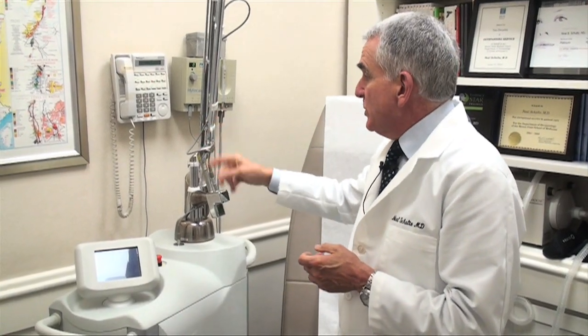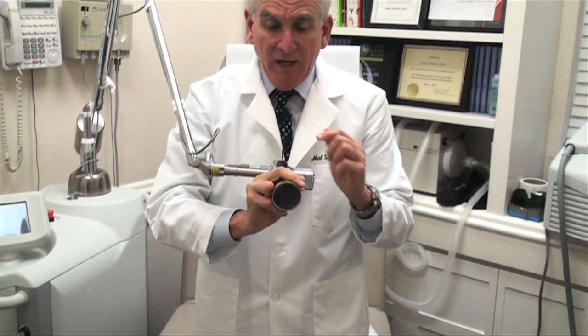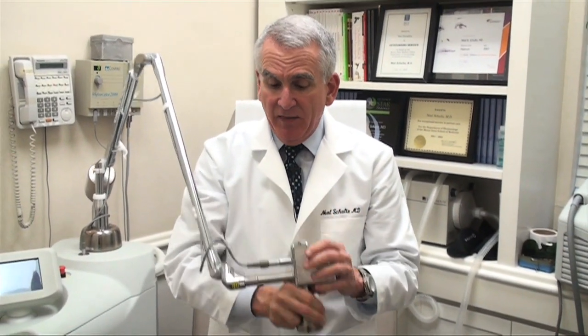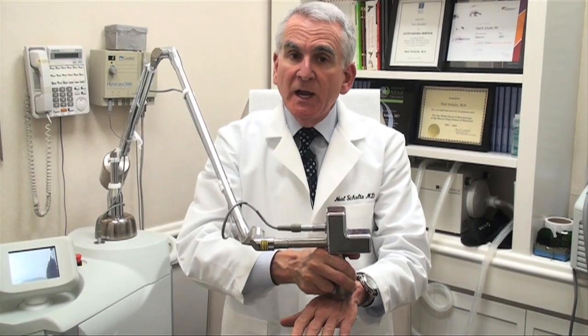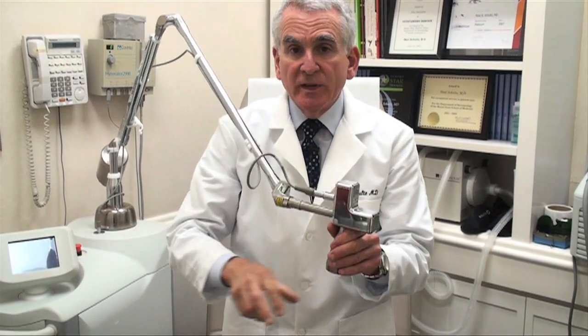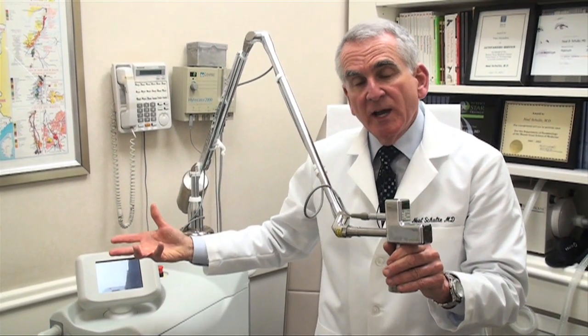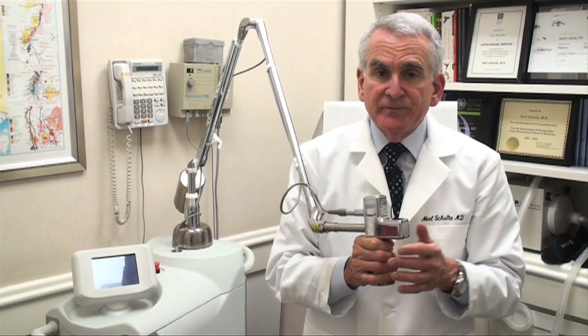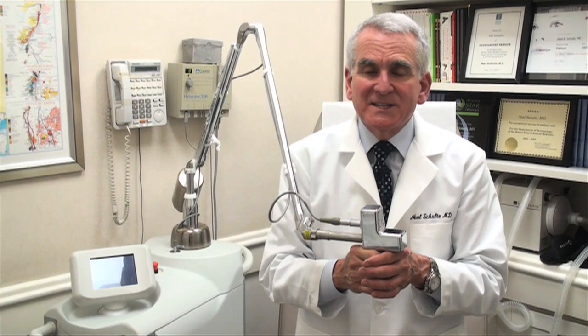The first laser I'm going to show you is the laser that we use to remove unwanted hair. This is the laser head, and that part is applied over the area of the body that has the hair. The laser fires repetitively. As it's doing that, I'm watching the screen, which tells me how much energy and how fast the pulses are coming. It's a very simple, straightforward procedure — it may take 10 or 15 minutes to do a leg or a bikini area, and it's a very well accepted procedure.